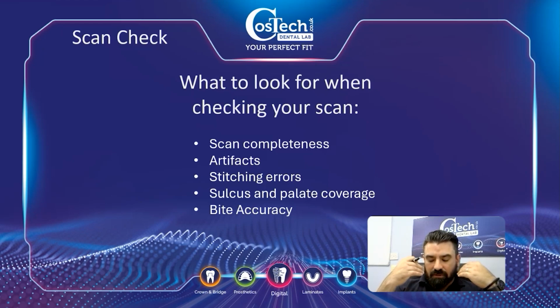We generally don't rely on clasps, because we have the scan, and when we're designing, we can actually see what level of undercut we might have to play with when we're creating a denture. We can add clasps afterwards, but generally we find with Digi-Dentures, because we can engage undercuts to a certain level, we can make sure of a good fit. But with that, making sure that we've got enough depth as well is imperative.